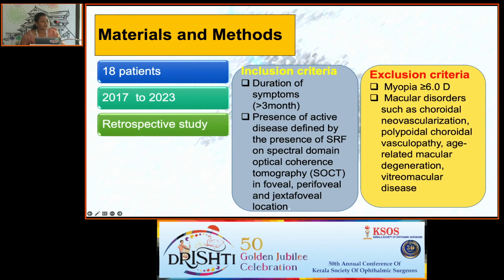Our inclusion criteria are duration of symptoms and the presence of SRF in SD-OCT in foveal, perifoveal and juxtafoveal location, and the exclusion criteria are myopia more than 6 diopter and macular disorders.